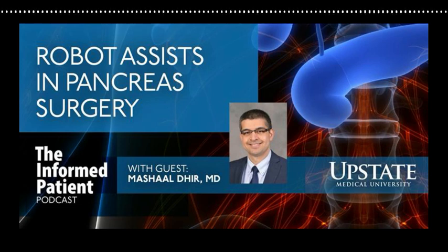Well, let me ask you, if you would please, to compare the open Whipple procedure with what's being done now using the robot. How does that work? With the open surgery, we work through a large midline incision. But for the robot, we usually make 4 or 5 small quarter-sized incisions on the belly and one near the belly button.